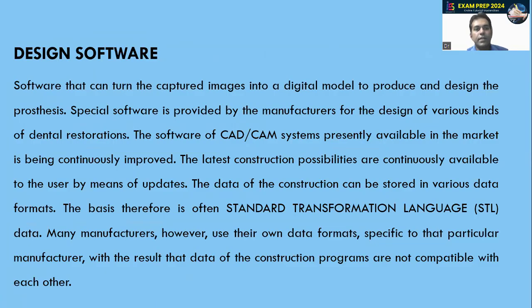Now, regarding the design software that can turn the captured images into a digital model to produce and design the prostheses. Special software is provided by the manufacturers for the design of various kinds of dental restoration. The software of CAD CAM systems presently available in the market is being continuously improved. The latest construction possibilities are continuously available to the user by means of updates.